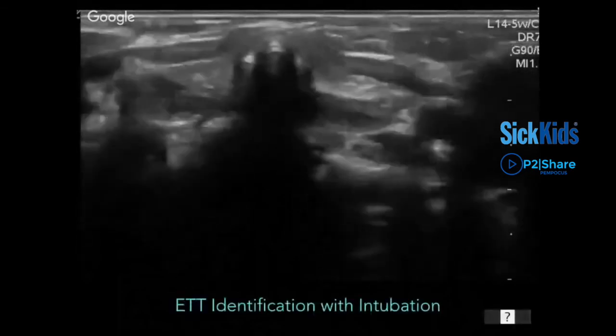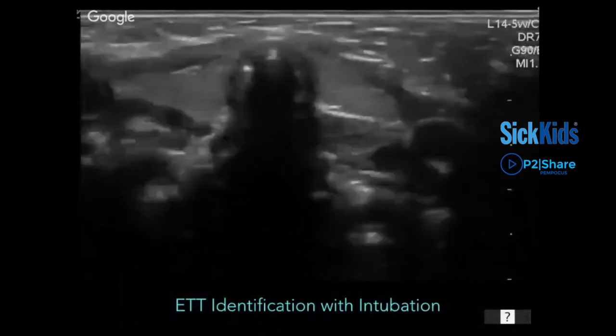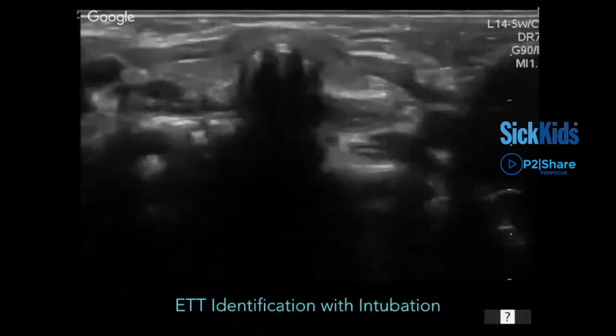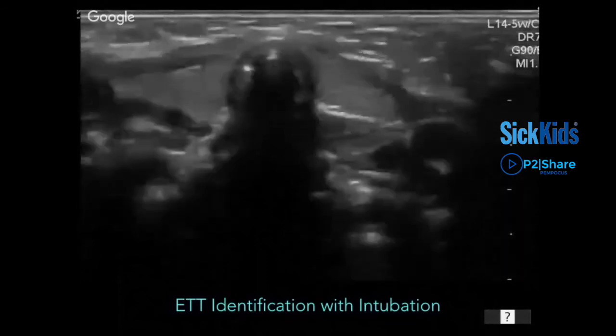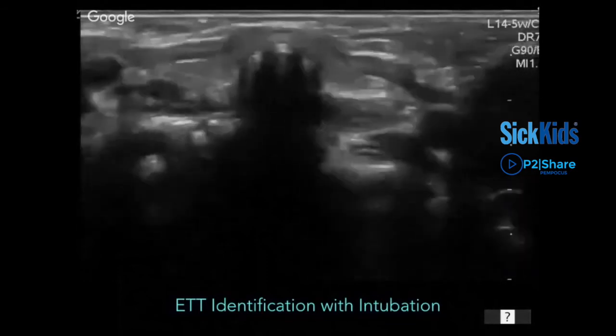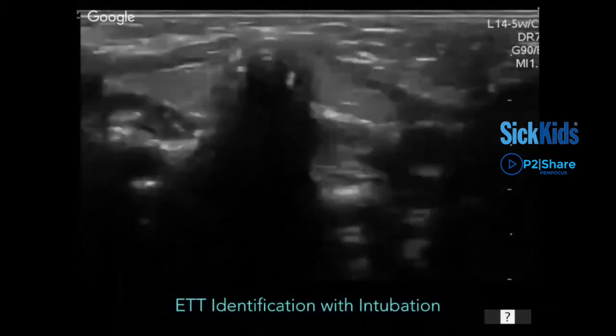Can I pause this? No, I cannot. Yeah, so it's coming out to the side so that we know that now it's back into the right place. In terms of the child, his vitals came back. He went to the ICU and the CT had a significant intracranial injury.